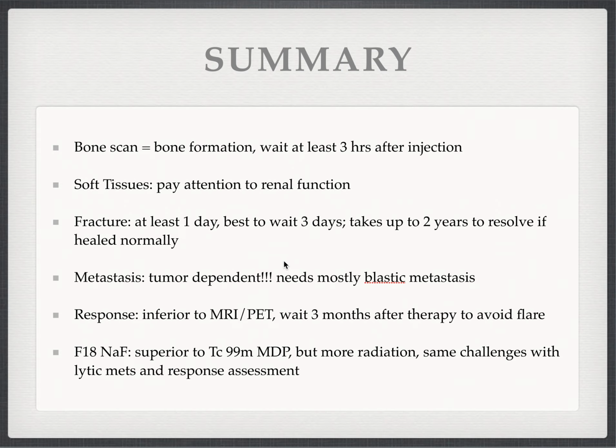Response assessment with bone scans is very challenging. We really should wait at least 3 months or preferably 6 months to avoid the flare phenomena. Sodium fluoride PET, it's a much better version of a bone scan at the cost of higher radiation, but in most circumstances an FDG PET is better.